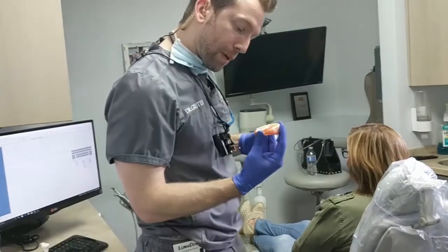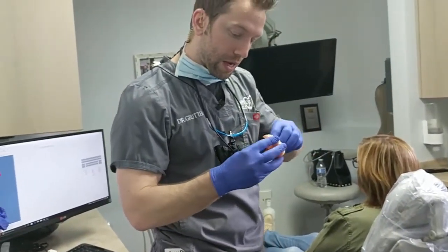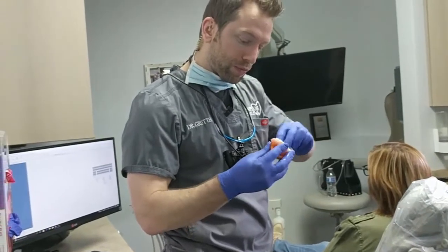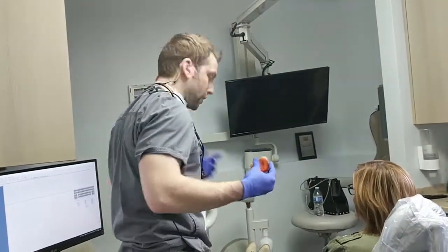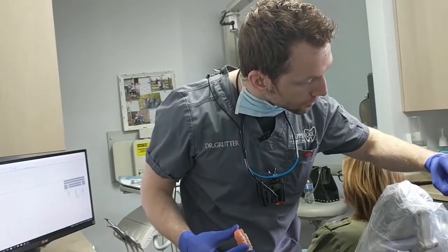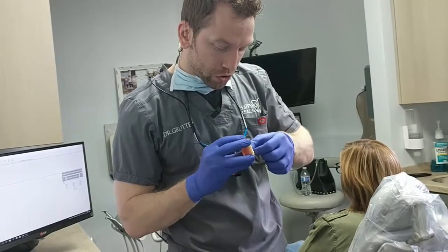If you didn't need to keep this denture, you could quite literally just drill little holes in it and put composite in there. It would probably be okay with this one because you only need it for a little while and she wouldn't notice those. But to me that's just more work, and I prefer to just use these stickers.